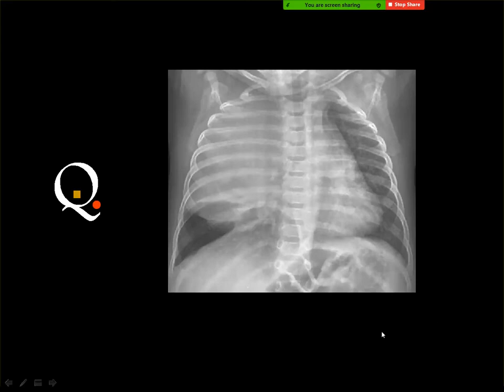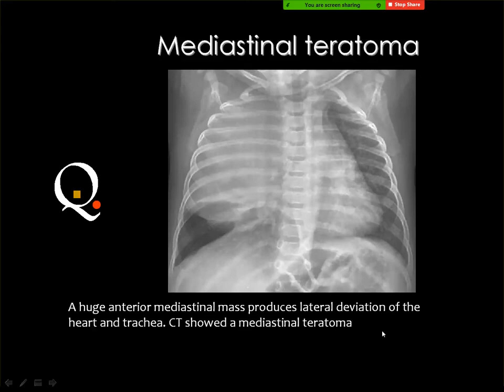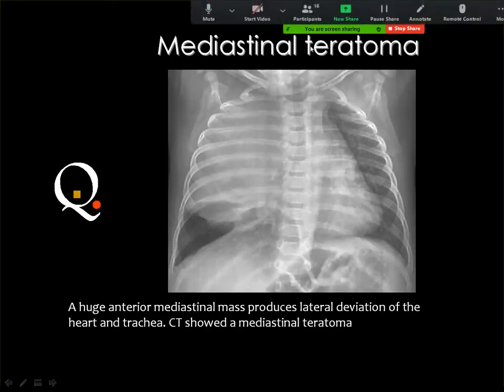Neuroblastoma. You should diagnose this every time as a neuroblastoma. Then the patient will go to have a CT scan. And at the CT scan, then you will see fat, you will see calcium in the anterior mediastinum. Then at that time, you can diagnose teratoma.